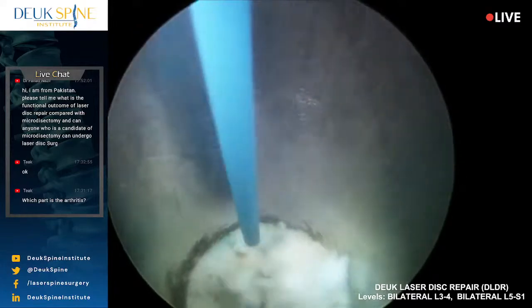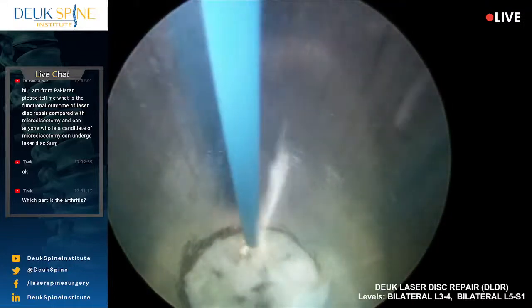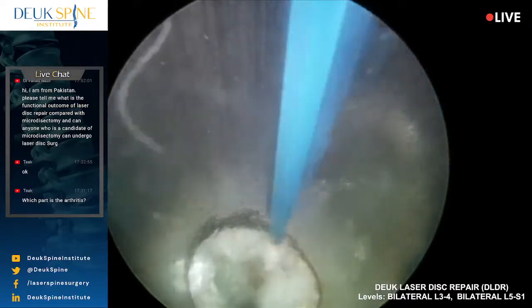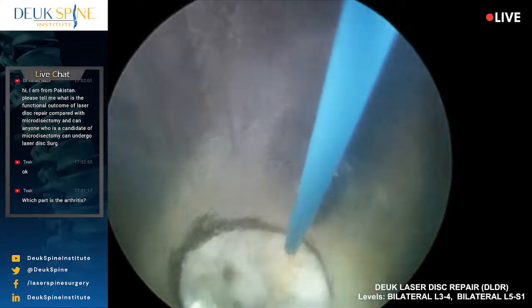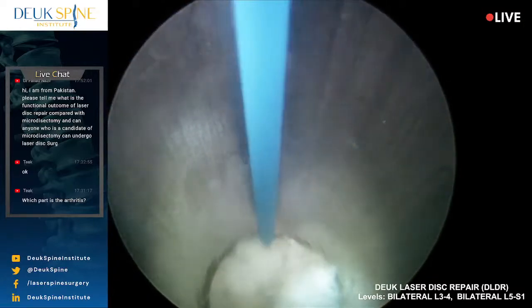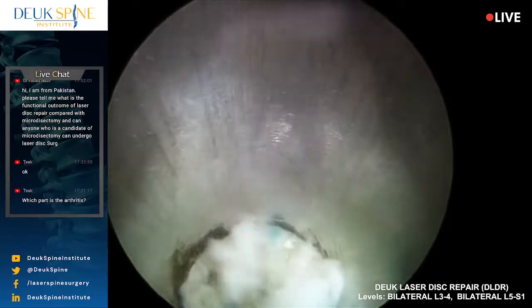I've never seen a disc so badly damaged. Honestly. Go back and watch all my surgeries. This is the worst. Luis, have you ever seen one so fragmented? It's unbelievable. The whole disc is literally, everything I can see here is just destroyed. He's still going to do fine, but I've just not had to repair so much before.